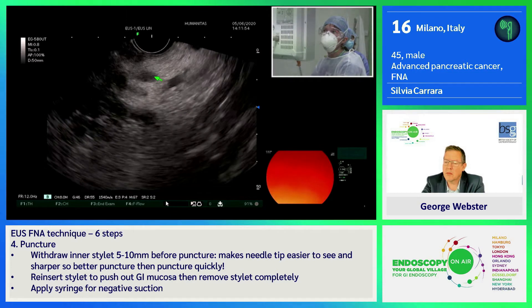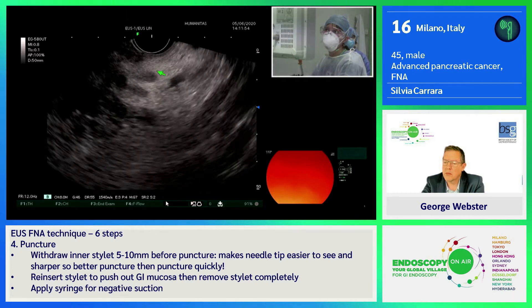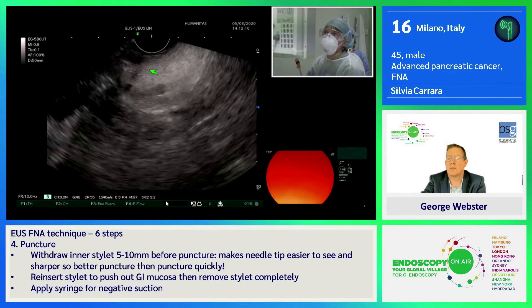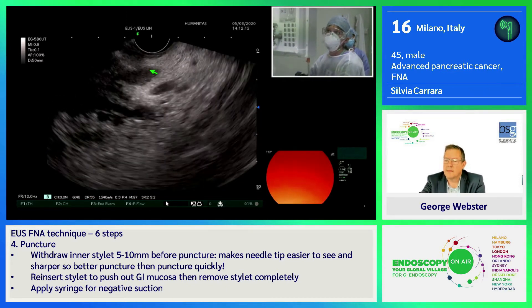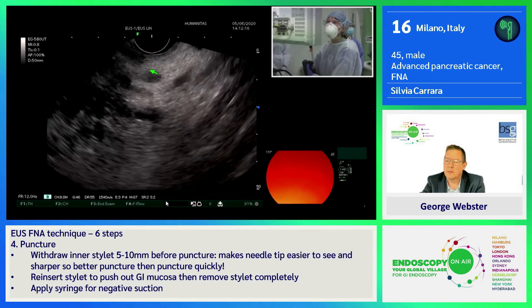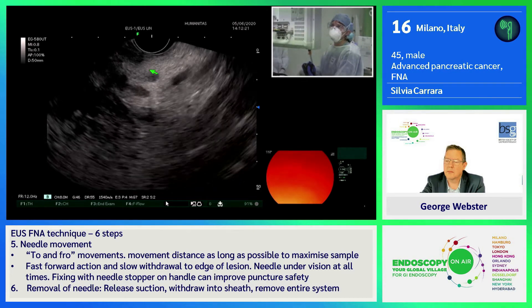We also have some lymph nodes here, so we have an N2 tumor as we can see with EUS. I'm going to puncture the tumor since it is not resectable and the patient will have chemotherapy. I'm using a Medtronic SharpCore needle, a 25 gauge.